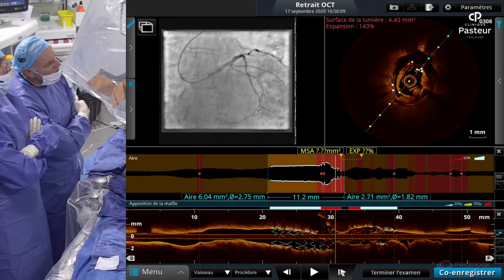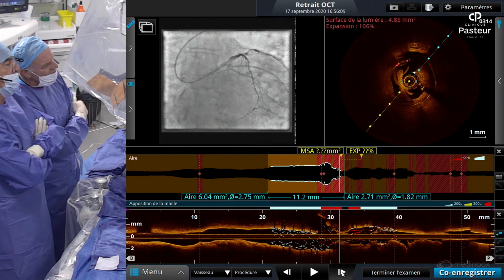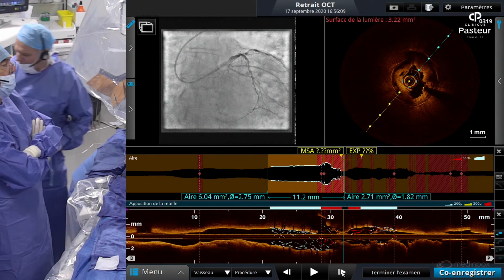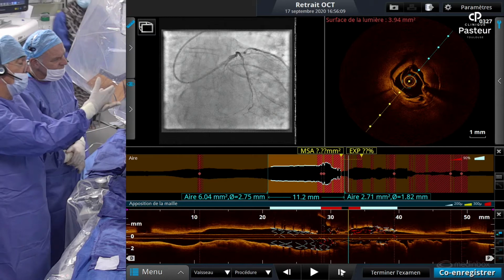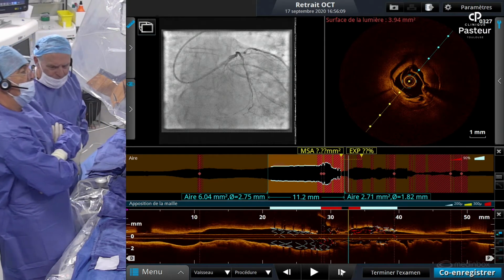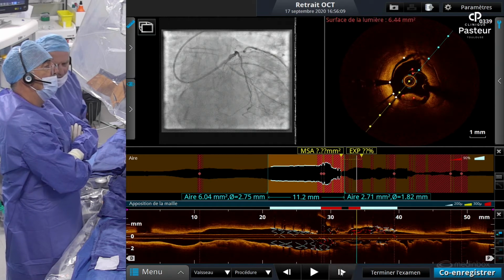And now it's the distal part of the left main, no? This is the plaque. It's the calcium. There is a plaque. Continue. And here, you see? I think that definitively there is a severe lesion here. On the cross-sectional view and on the longitudinal view, you could see very well the plaque. Here, look at that. Wow.